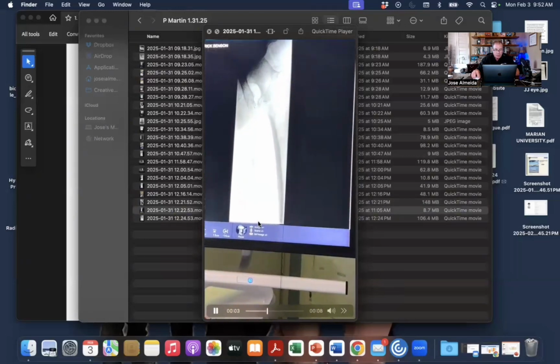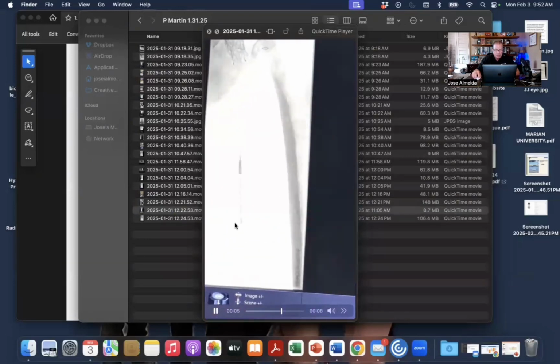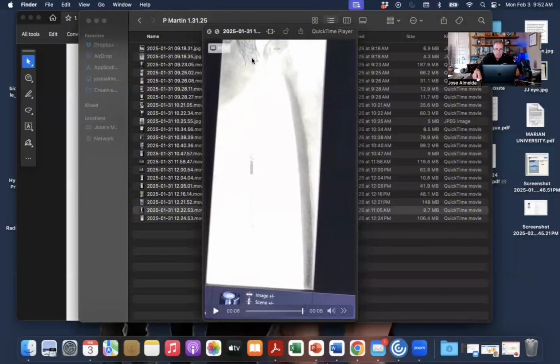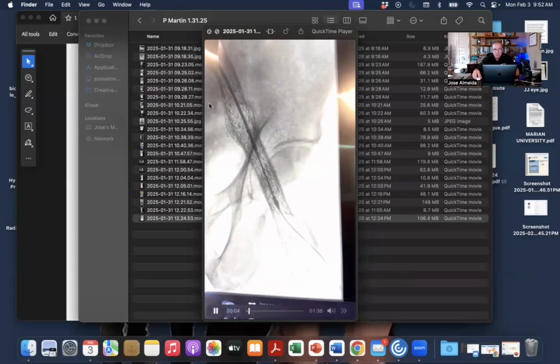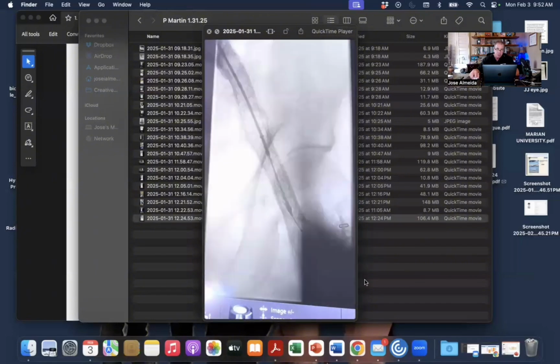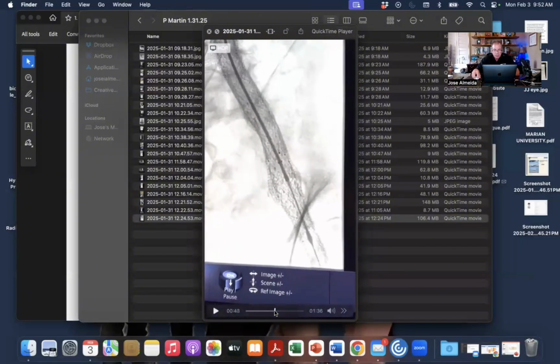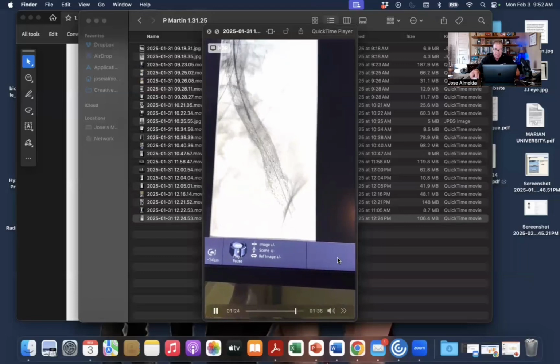This is from the posterior tibial vein access, a Triforce catheter coming up, trying to wire and cross this area that was completely occluded. Again, working from above with a Rev Core and below, try to get this segment open. And you spend some time, there's a lot of friction in the system. It just wasn't going great. So at the end, we just decided to stop and maybe come back another day.